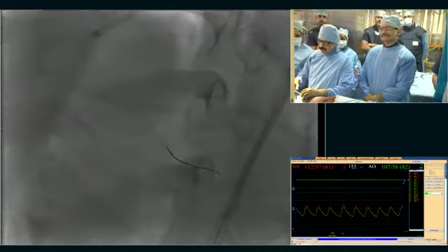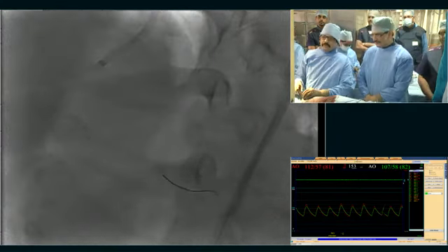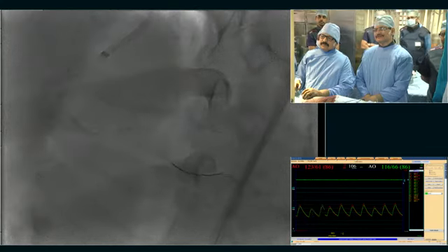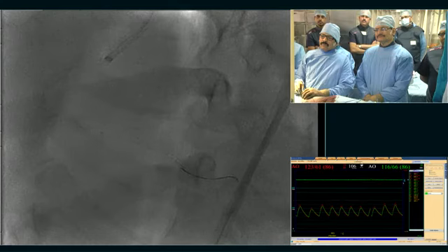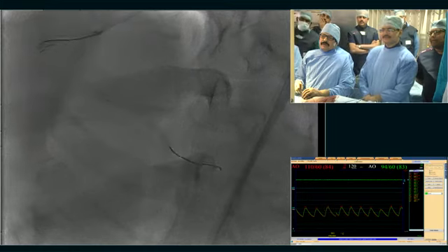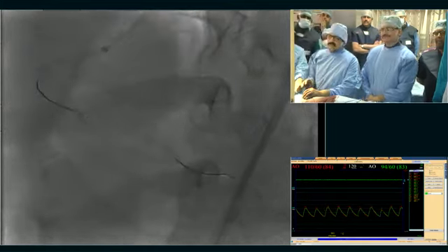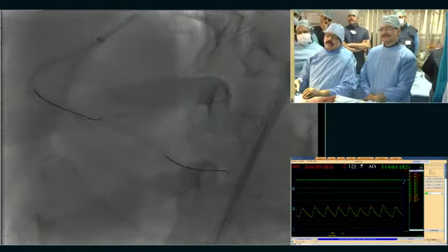3.5 dilate, below can see 3.5 dilation. After opening this one, I can. So you modified the curve of the Sion, the tip. If not, I will try to do with a whisper next time. Yeah. And same. It went.